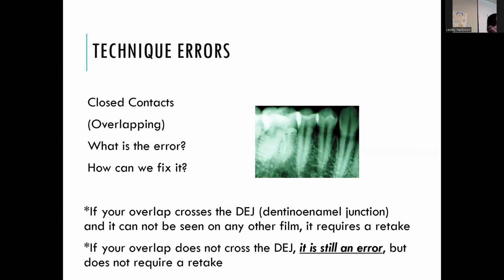It's harder for a maxillary because you can't really visualize it, but you still get used to it. You can imagine that line, just like with the bisector, and think, this is the angle I need to open the contact. It really becomes that once you're accustomed to taking films, but in the beginning that's not so common.